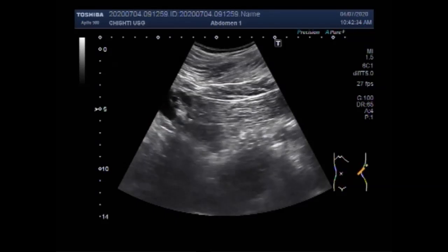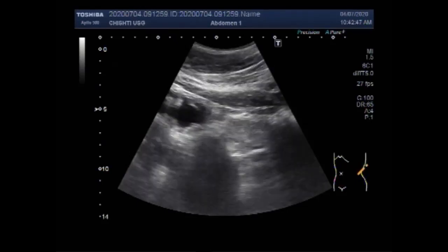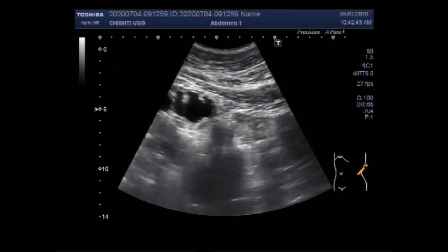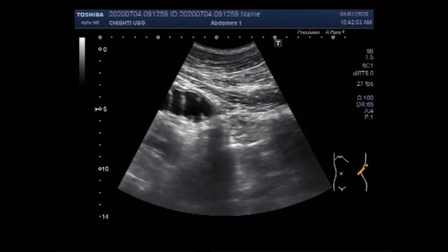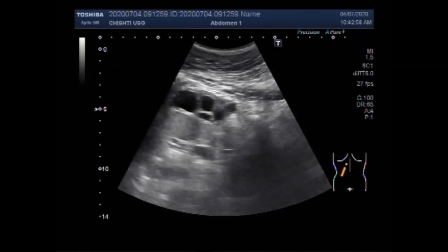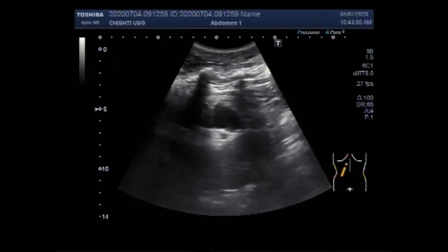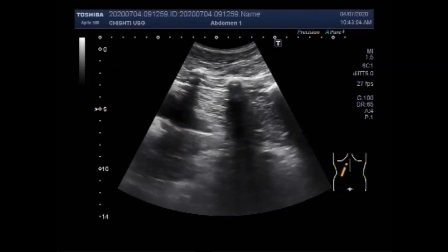This was basically resultant of the trabeculated urinary bladder which caused the stenosis at the ureterovesical junction. On the affected side you can see there is gross hydronephrosis but there is minimum hydroureter. You can see the ureter is not dilated — there is minimum hydroureter.